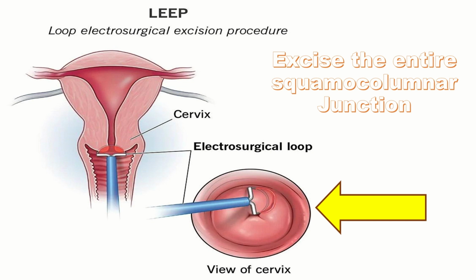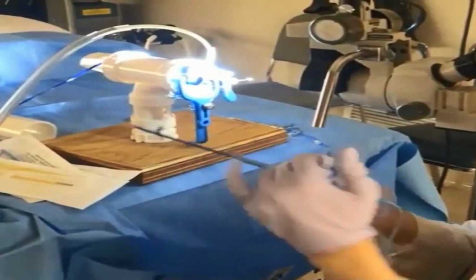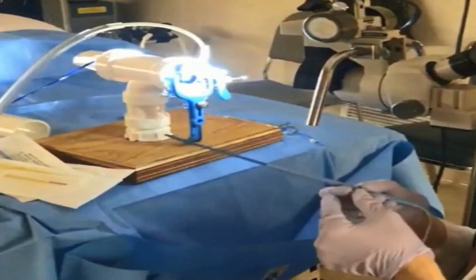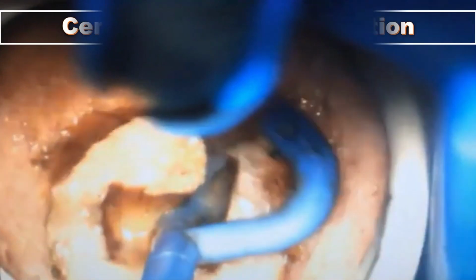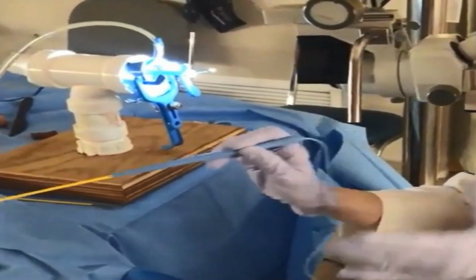The first important step of this procedure is the use of local anesthetic. Numb the cervix by mixing lidocaine with epinephrine. Next, the LEEP electrode and the whole equipment is made ready to use. The tip of the bar of the LEEP electrode goes inside the cervix and then it is rotated counterclockwise. In this way, the specimen is taken by using a wire loop heated by electric current, which removes cells and tissues. Sometimes we use a different type of LEEP electrode when the shape of the cervical os is not regular, as in the case of a multiparous woman.